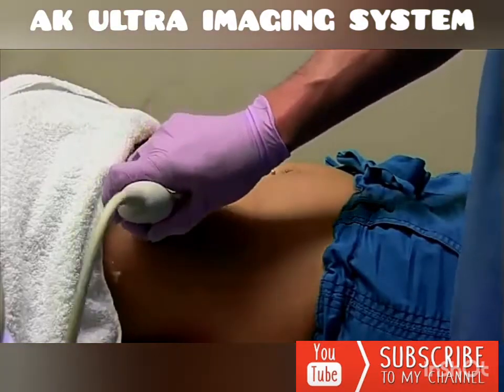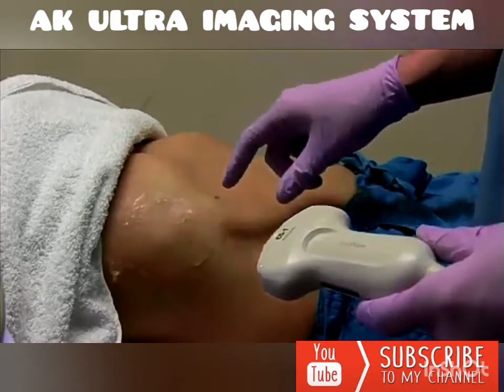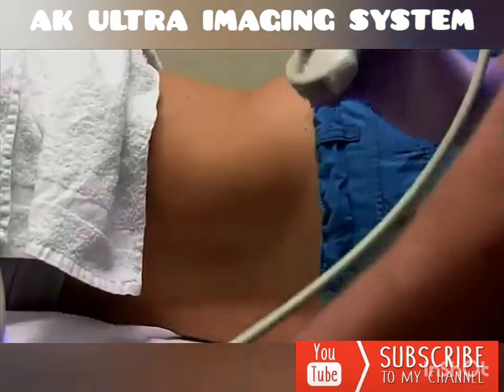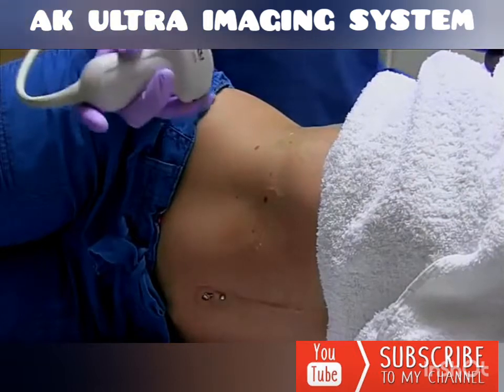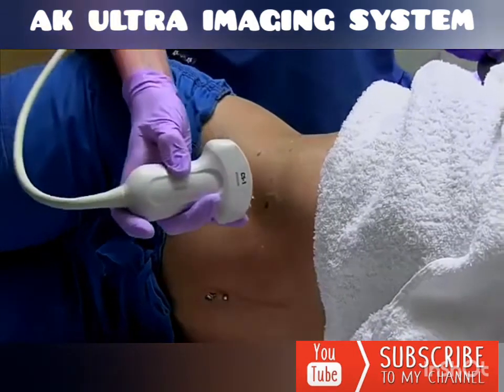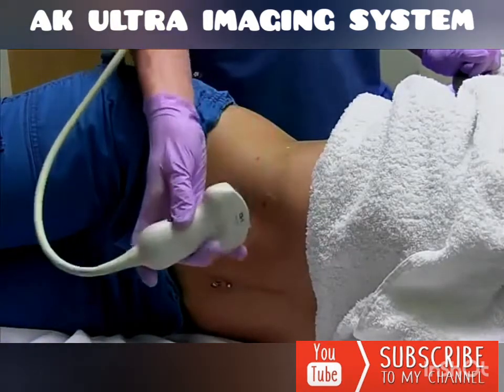For the gallbladder, we also get decubitus pictures just to make sure there's no stones trapped in the fundus or the neck of the gallbladder. So for that, I'm going to have you turn onto your left side away from us. For this, the gallbladder usually moves a little bit forward. So after you get your supine pictures of the gallbladder, you want to decubitus the patient just to make sure there are no stones stuck in the neck of the gallbladder. You have the patient turn on their left side away from you, and that usually brings the gallbladder forward here.